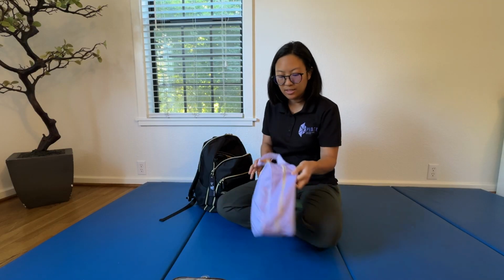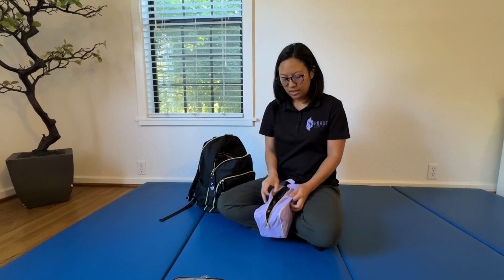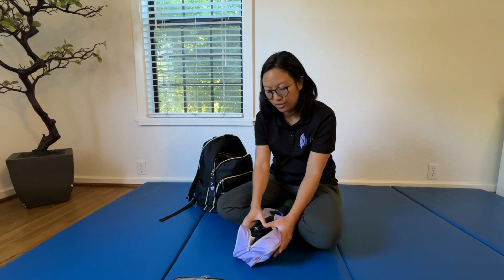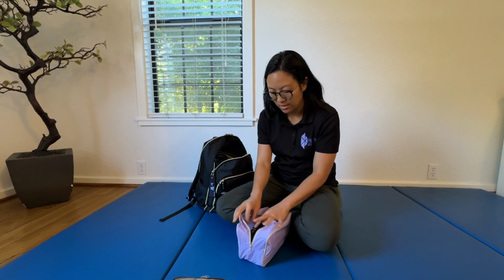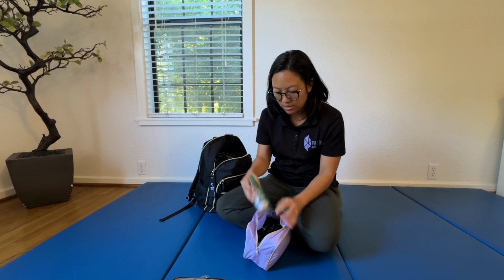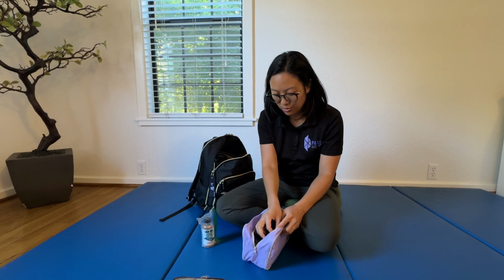Cool. And then last but not least, my ANF bag. ANF Academy did provide for me a bag, but it was kind of tough for me to reach from the top loading and find all my devices. With this, I like that it opens up sideways, so I can actually filter through each of them vertically before I pull them out. But ultimately, what I keep in here, I have my Skin Tack liquid adhesive in case I need to make it stick again.